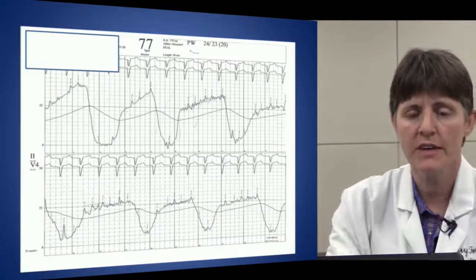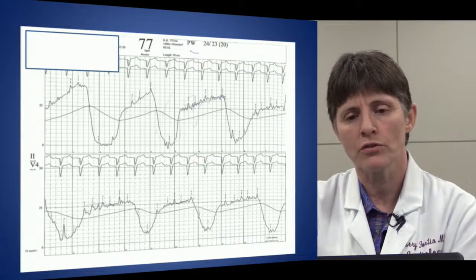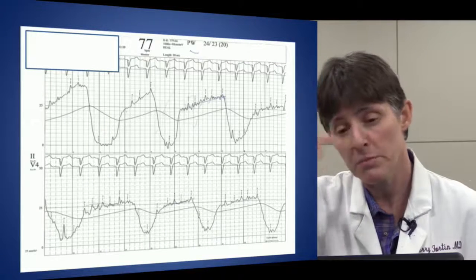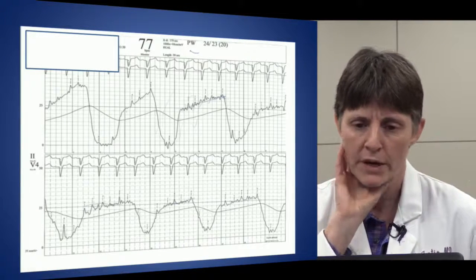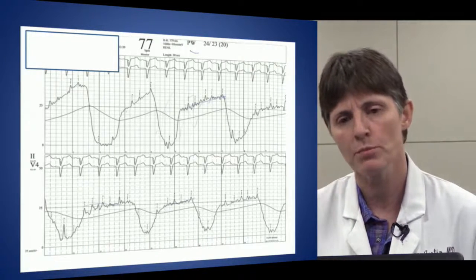One other wedge tracing, in the top screen, the person is bearing down a little, so it never flattens out. It has this slow rise going up, and it would be hard to pick a wedge. In the bottom tracing, we can sort of see some flat level areas, so wedge is about 25. Again, these big dips are inspiration.